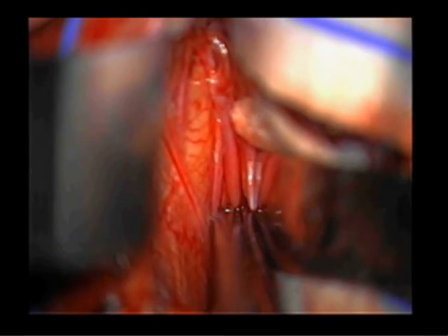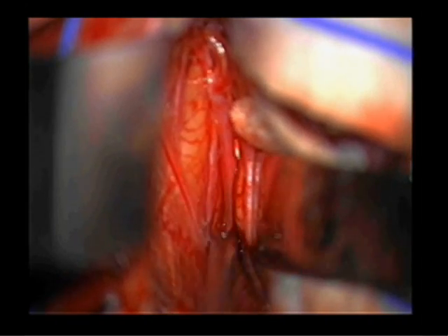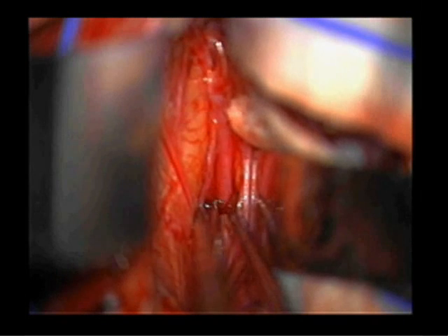The interhemispheric fissure is visualized and the arachnoid bands are carefully dissected while retractor blades are used to deepen the exposure.